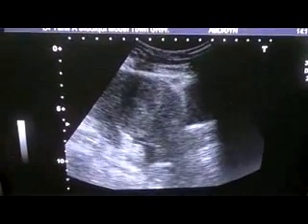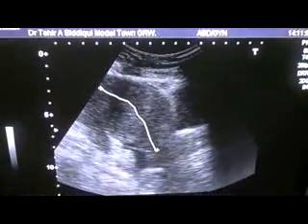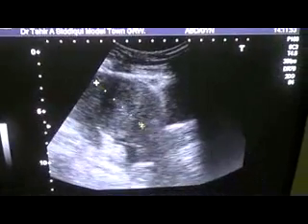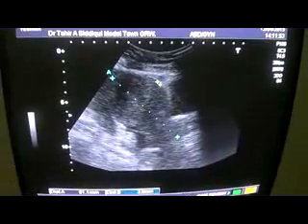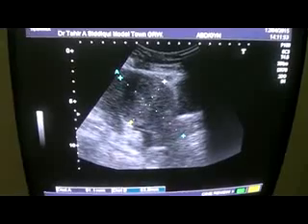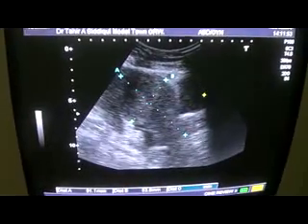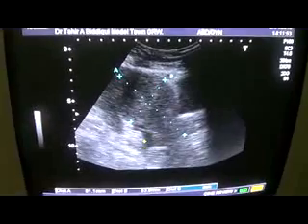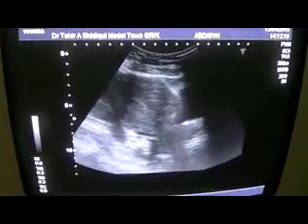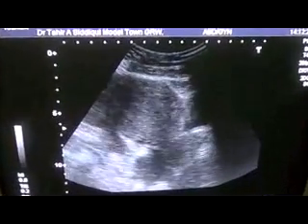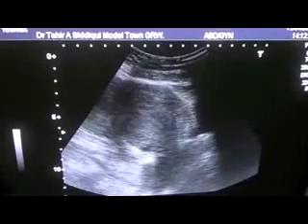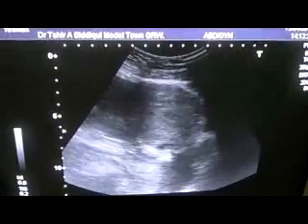This is the longitudinal section of the uterus, measuring 9.1 cm by 5.3 cm. This is the urinary bladder in longitudinal section with a small amount of fluid seen. There is no evidence of any gestational sac within the endometrial canal. There is also no history of spotting. The endometrial canal is clear of any clot, retained products of conception, or gestational sac.